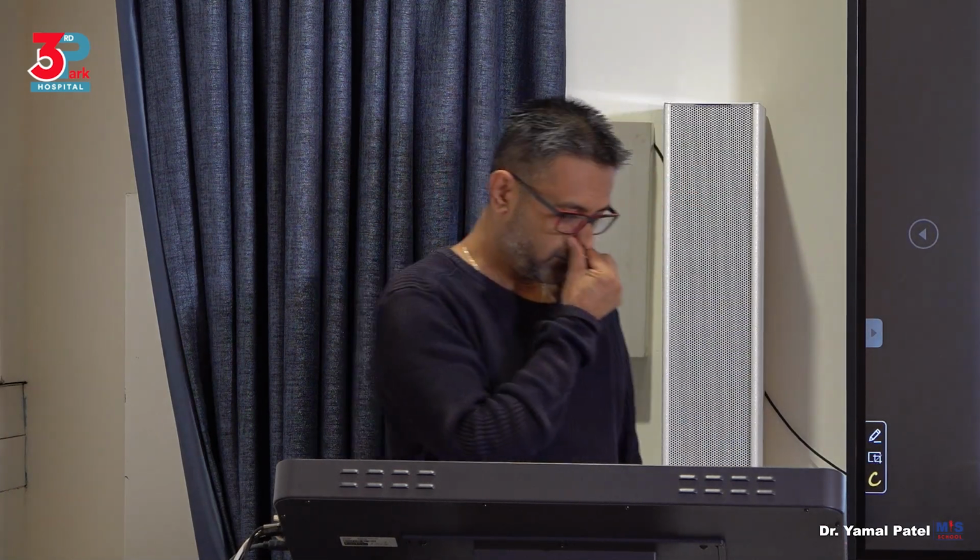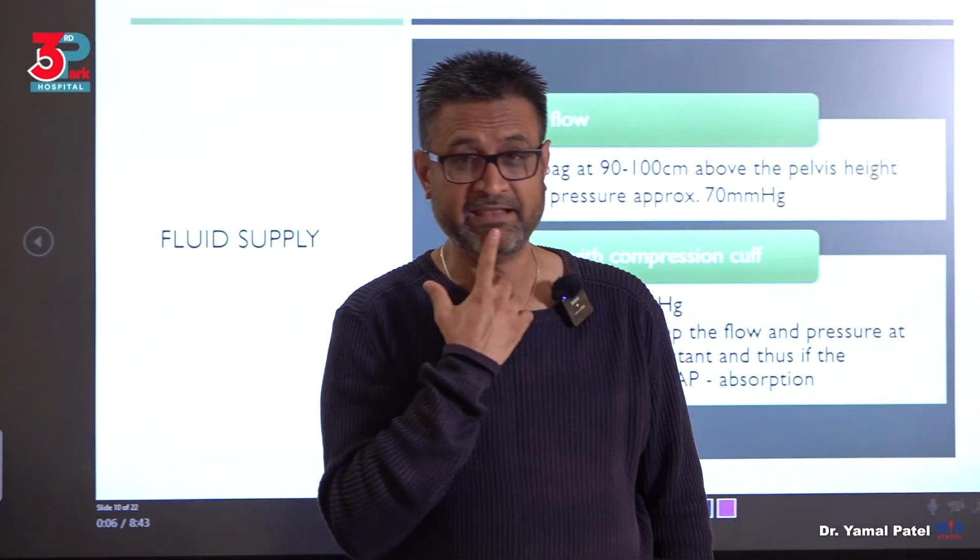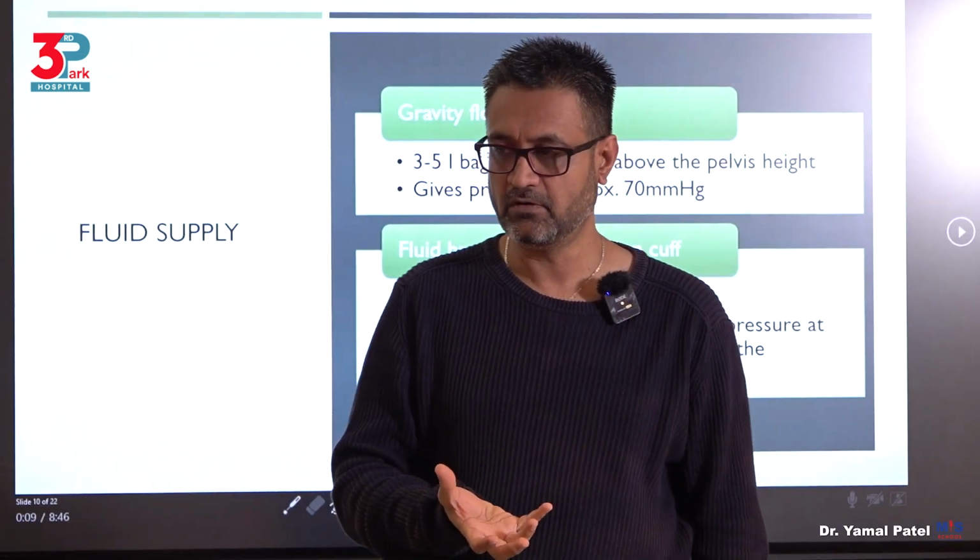Dextran 32 is high viscosity, hyperosmolar, and you would have an issue with how much volume you can infuse. So it now means that we are mainly talking about saline, right?